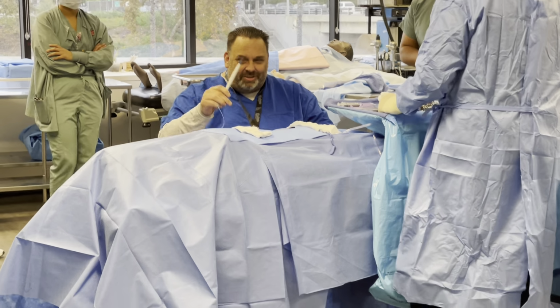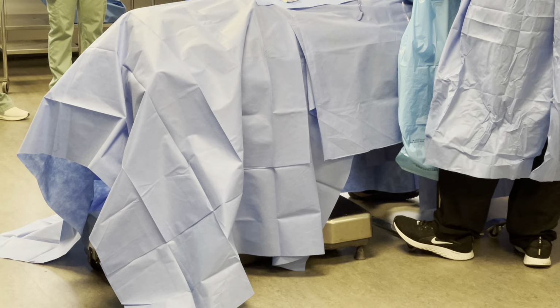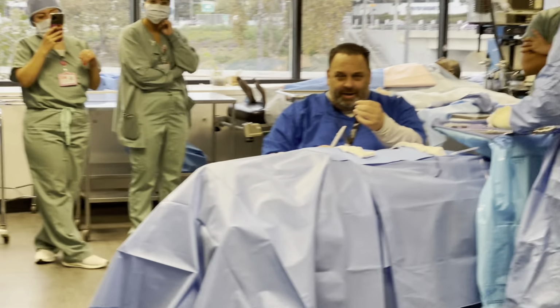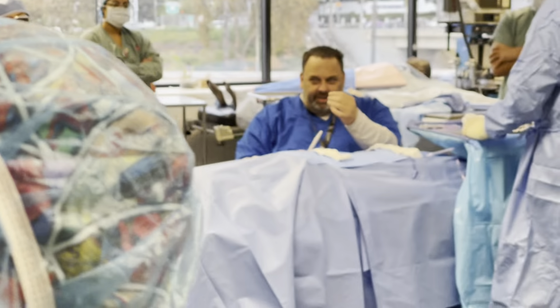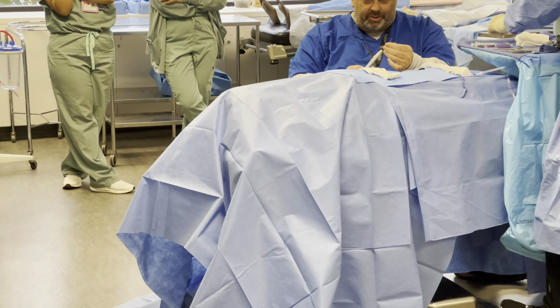As far as the Bovie goes, this tip, the electrode part, comes in and out. It can be turned 2 ways: a flat way and a sharp way. Think of a knife cutting bread, and a knife buttering something, right? You want it so that it's gonna do cut.